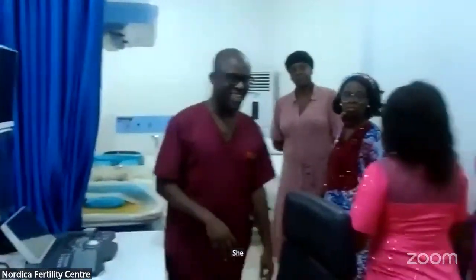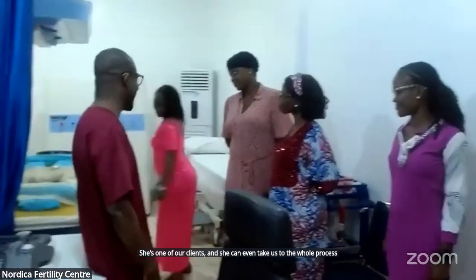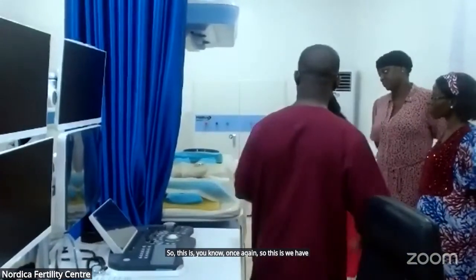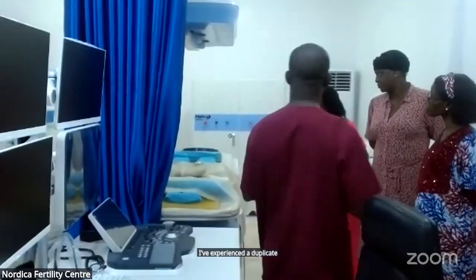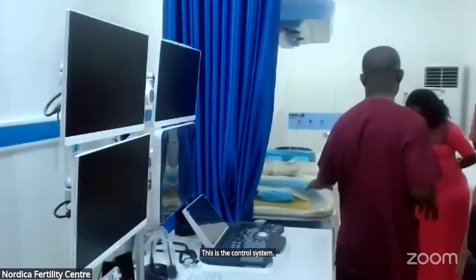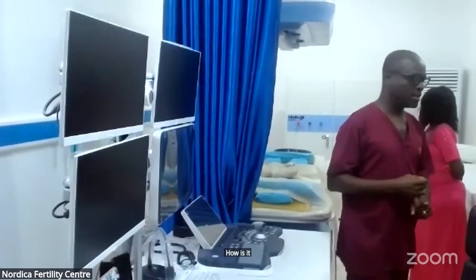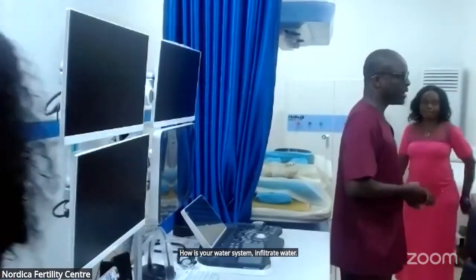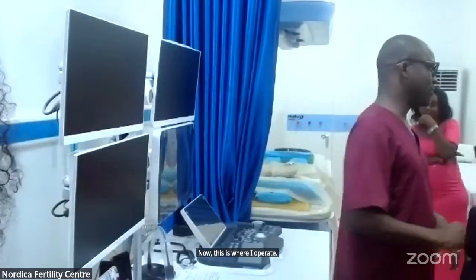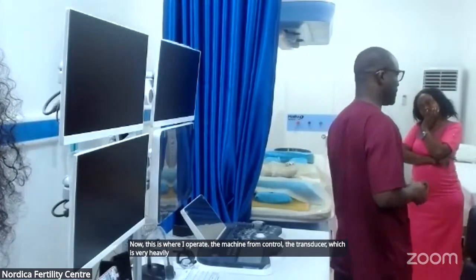She's one of our clients, and she can even take us through the whole process. You are welcome once again. So this is the HIFU machine, high intensity focused ultrasound. We have three parts. This is the control system, this is the bed where the patient lies, and the box over there has the water system, the filtered water, and the power source. This is where I operate the machine from, controlling the transducer, which is where the energy that we use to kill the fibroid comes from.